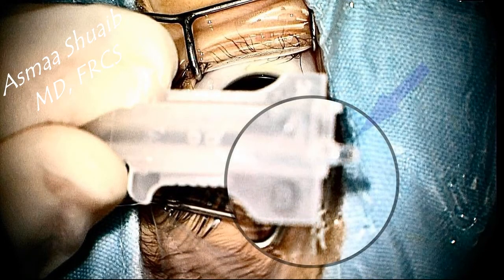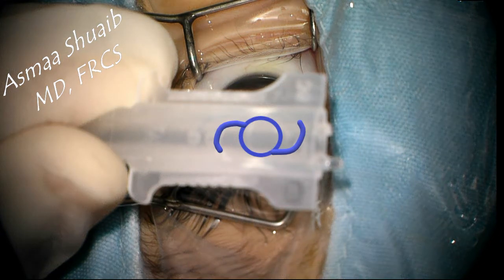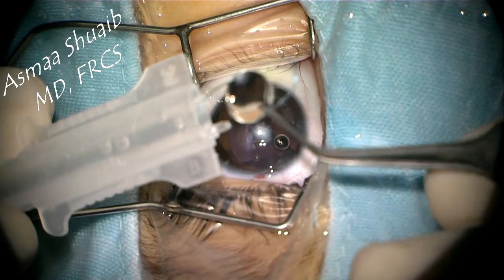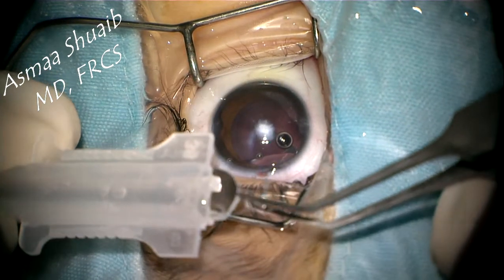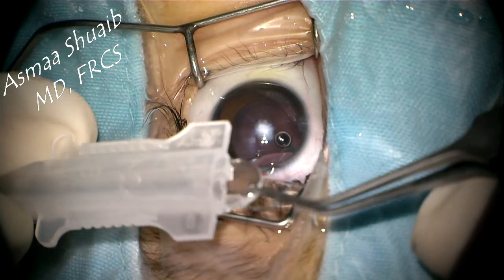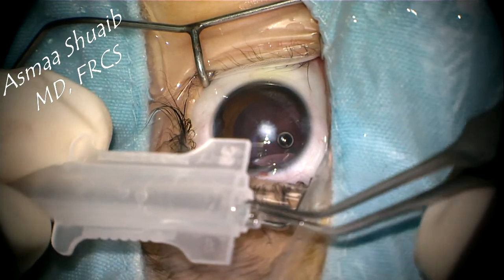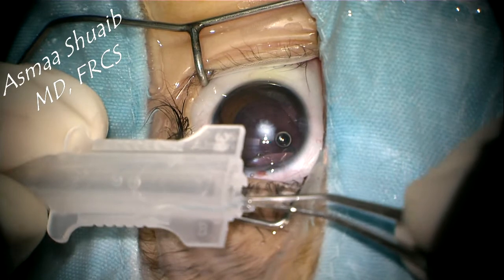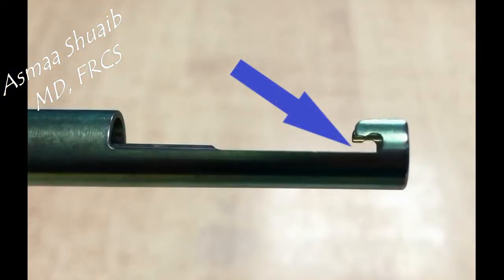The B cartridge has a terminal knob that is used to hang the haptic of the IOL and keep it away from the plunger. You can also see a small letter denoting the type of cartridge. To load the IOL in the cartridge, follow the Z orientation drawn on the surface of the cartridge. Push the optic into the lower part of the gutter and keep the haptic hanging at the outer surface of the knob to prevent breakage during pushing.